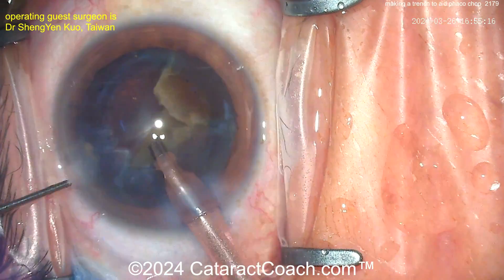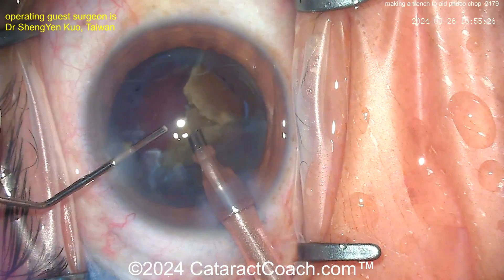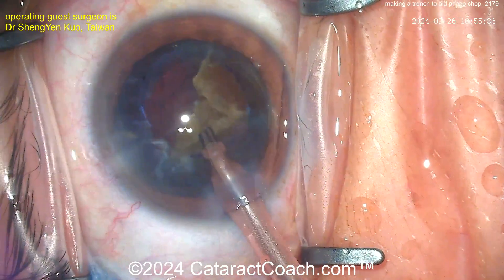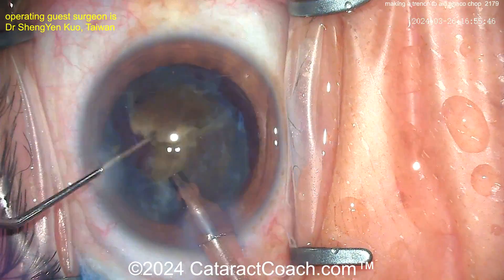Now we're going to recoat the endothelium with the viscoelastic dispersive agent — going inside. Good recoat of the endothelium — look at that, beautiful. Now the remainder of the nucleus, the other half, can be removed.